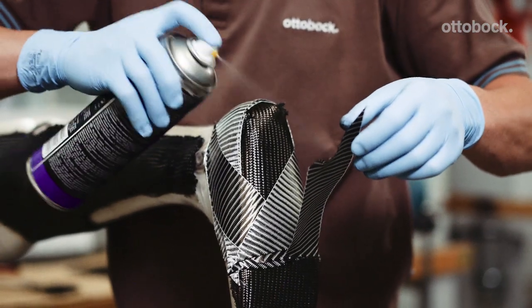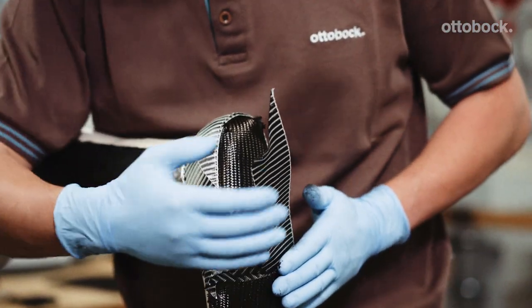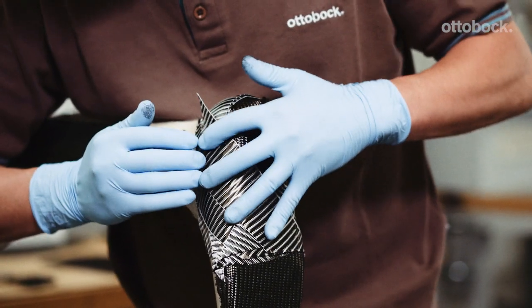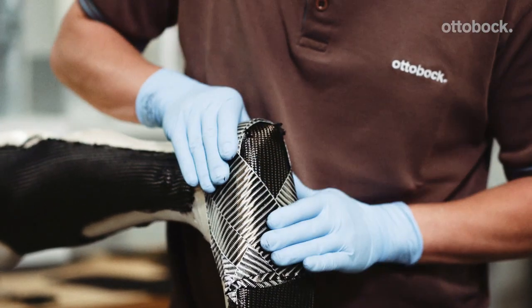Apply two medial and two lateral layers of UD carbon on the foot component from the ankle joint to the rollover edge. Trim the edges of the carbon so that it ends flush with the rollover edge.